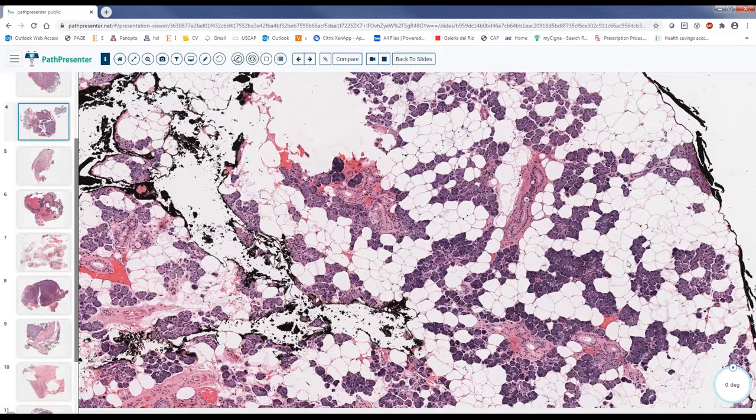When it is serous, you have the R in parotid and the R in serous. Parotid, serous. So this is parotid. If you have sublingual, it is mucinous. Sublingual, mucinous. Submandibular is a mix between mucinous and serous.